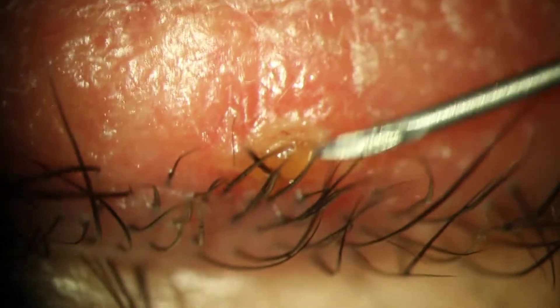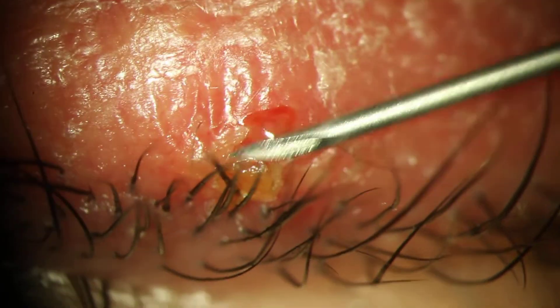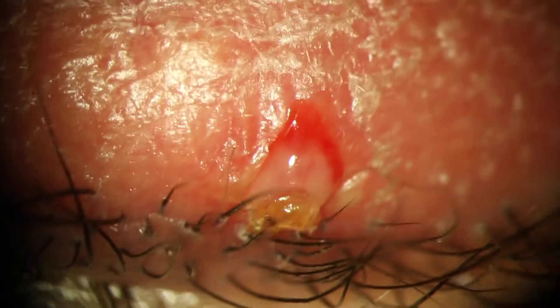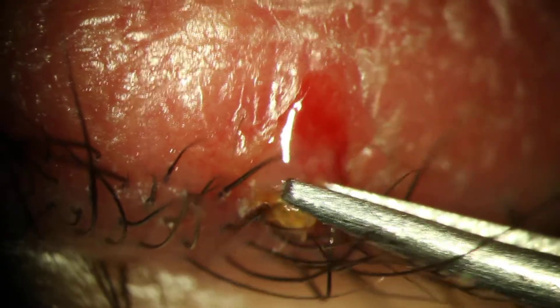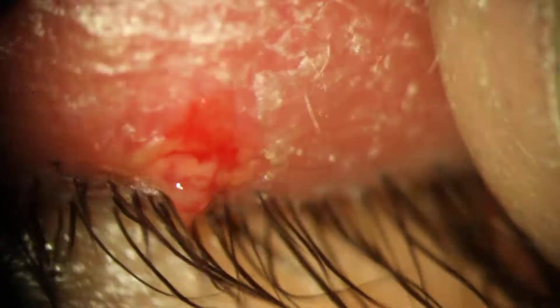I'm just going to kind of scratch on it a little bit and see how it does. That was kind of in your eyelash a little bit — there you go, good.